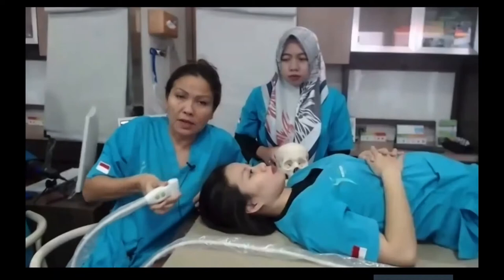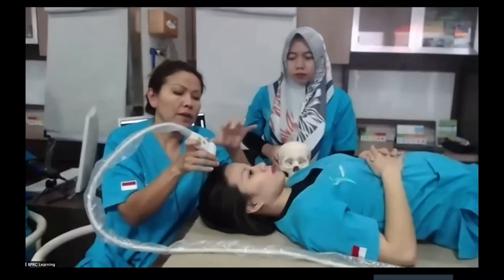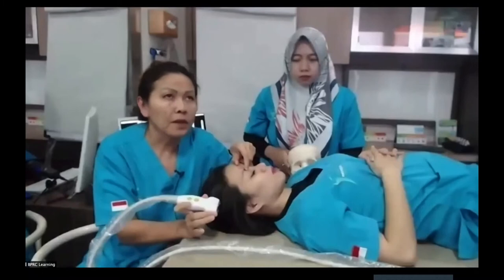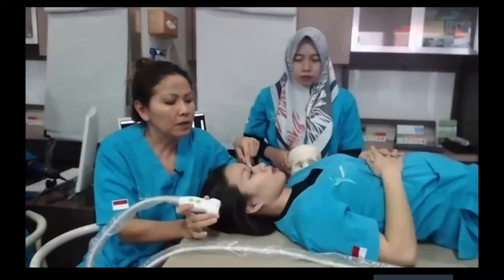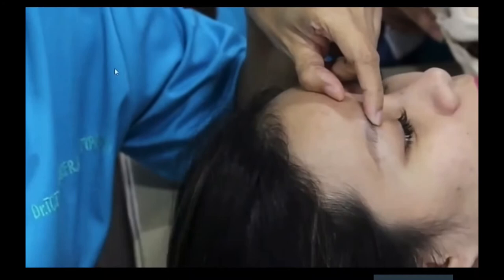Because when I do intervention, I must hold the probe still firmly, so then the structure seen on the screen will not get lost. Okay, so try to palpate here at the eyebrow. You can try it on your own eyebrow. Maybe you can feel there's a gap there, a fissure about 2.5 centimeters from the midline. This is the nose to the midline here. Maybe you can feel a pulsating artery there. Do you feel it, Ebrina? She said yes.